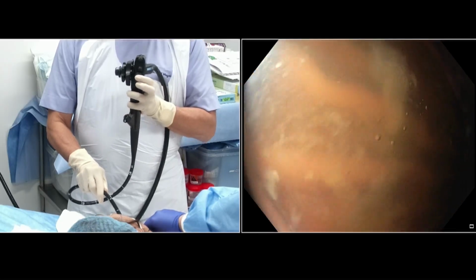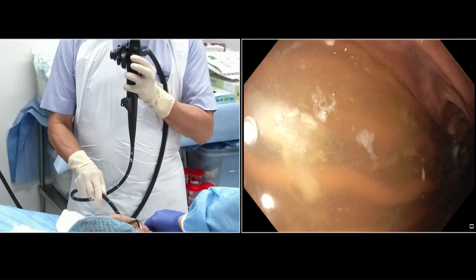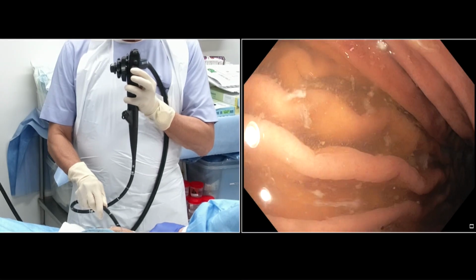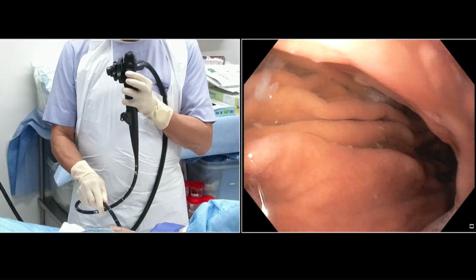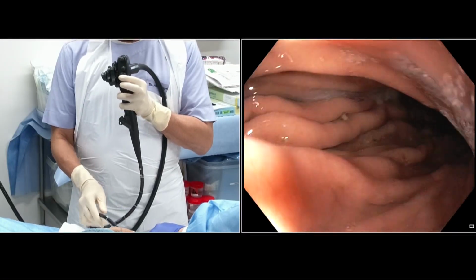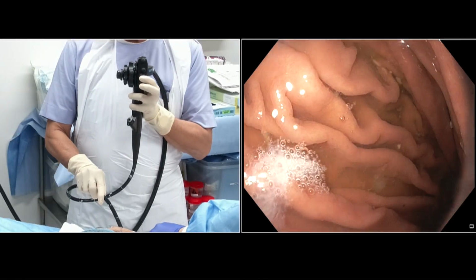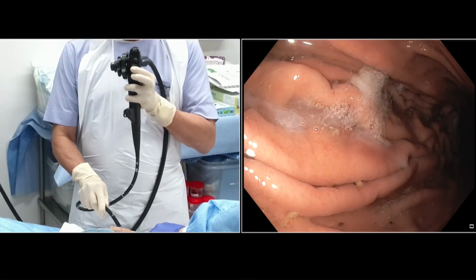Now first thing I am going to do, you see my left index finger now, I am going to suck the fluid which is there in the fundus, so that the chances of this fluid coming up and aspirating are reduced, because these procedures we usually do under sedation. And now once I have sucked out that fluid, now I pass the scope inside, and as the scope is going, now see what I am doing.